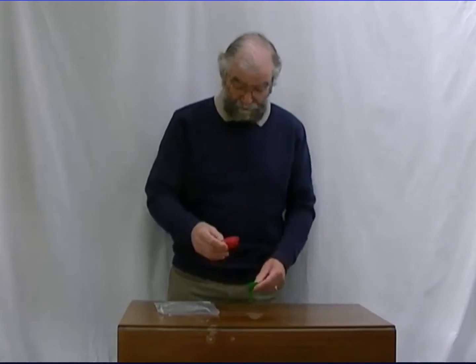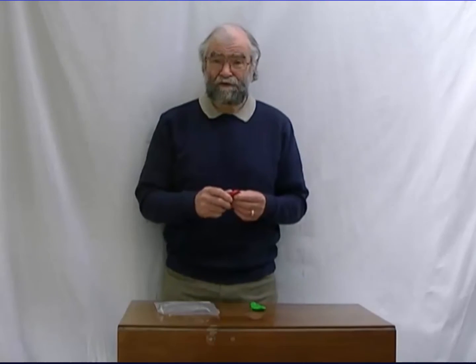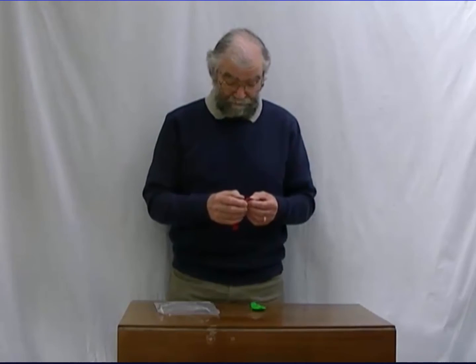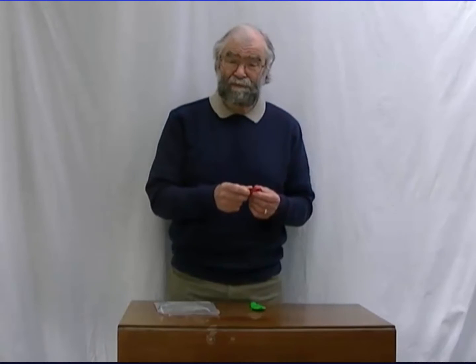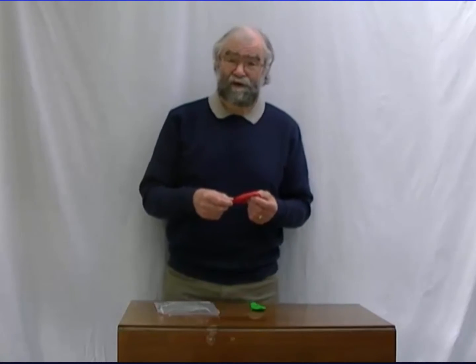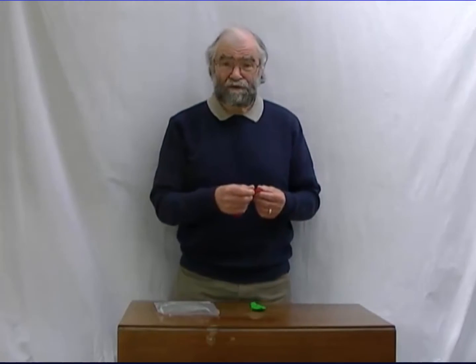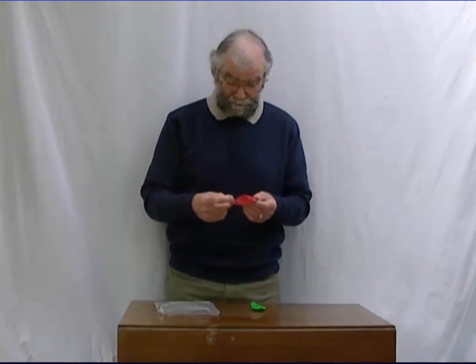So if we come to this red balloon, this is going to represent an obstructed system with an obstructed Pelvi-Ureteric junction. To demonstrate that, I've had to make the hole representing the PUJ much smaller in this one, so it represents a physical obstruction. In a real Pelvi-Ureteric junction obstruction, it's much more likely to be a lack of function rather than an anatomical one like this, but that's the best I can do with these balloons.